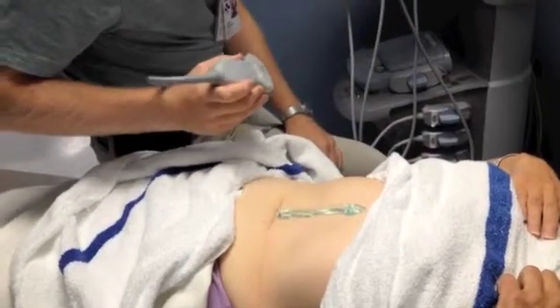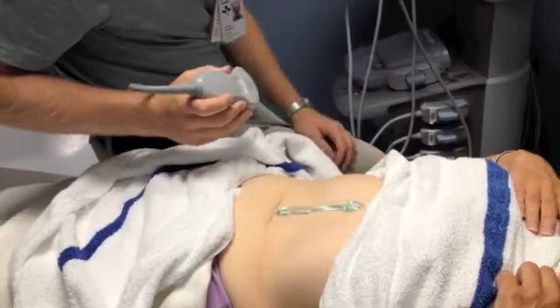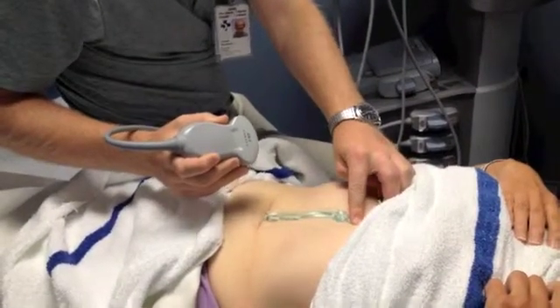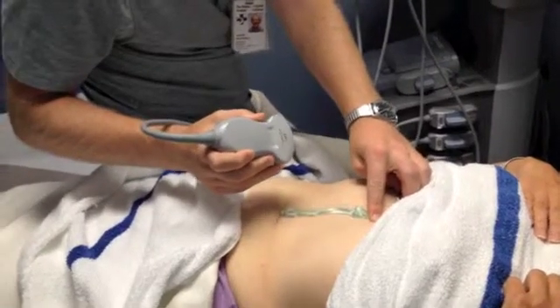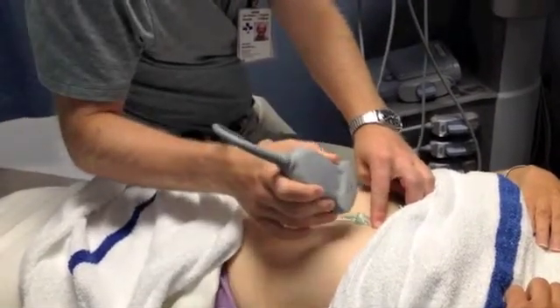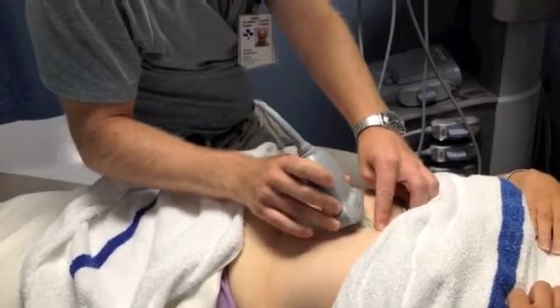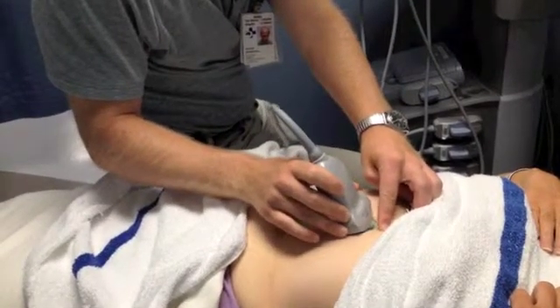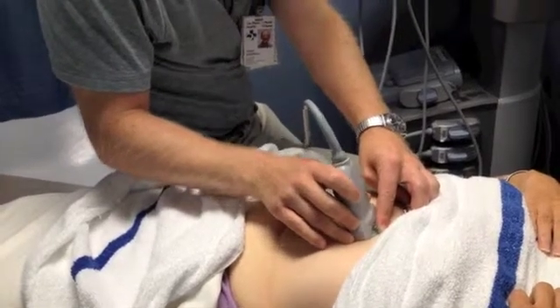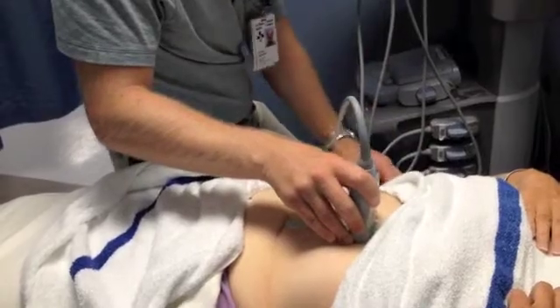Let's do a scan of the aorta. First of all, put lots of jelly on the belly. Next, feel the xiphoid process. The xiphoid marks where the diaphragm is inside the body, and that's where the abdominal aorta begins. Once I feel the xiphoid, I put the probe right up against the xiphoid, and then I bring the probe up completely perpendicular.